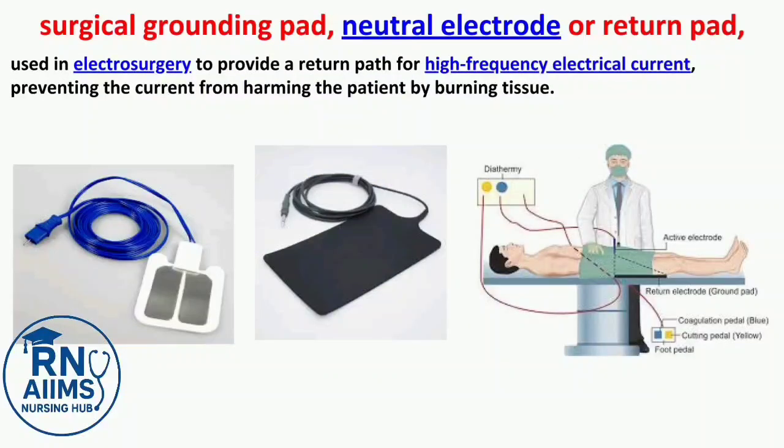Surgical grounding pad, neutral electrode or return pad. Used in electrosurgery to provide a return path for high-frequency electrical current, preventing the current from harming the patient by burning tissue.